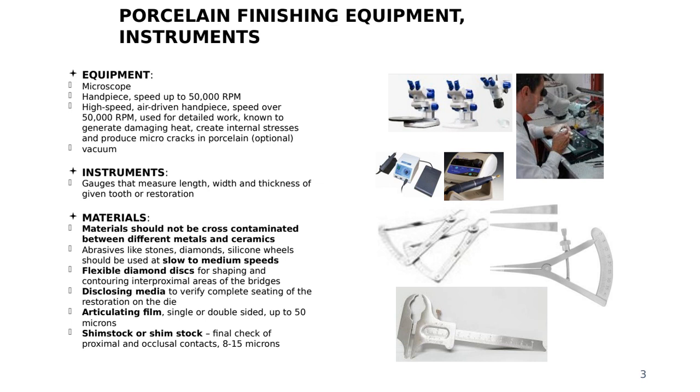It's still there. So through the whole process of building up, recontouring, reshaping and baking, you have to keep in mind the requirements and parameters of the substructure. Always keep that in mind.